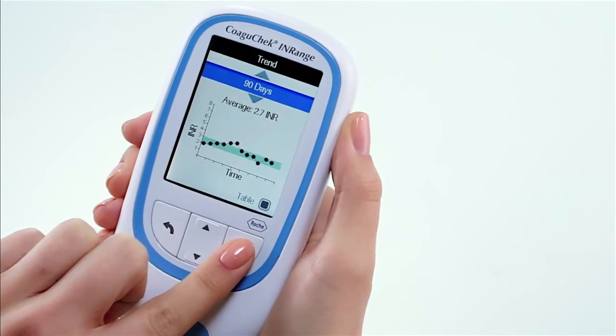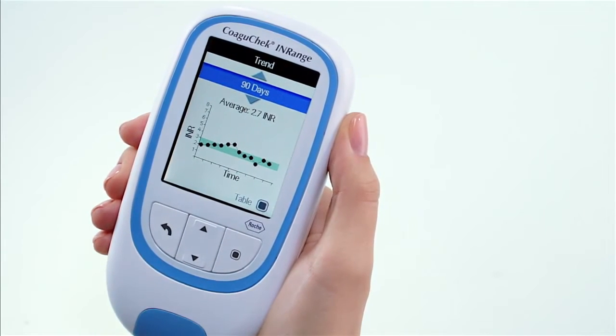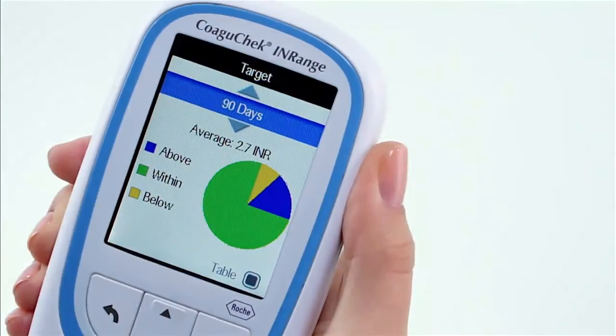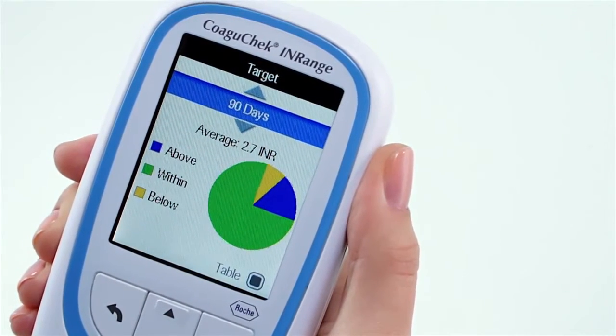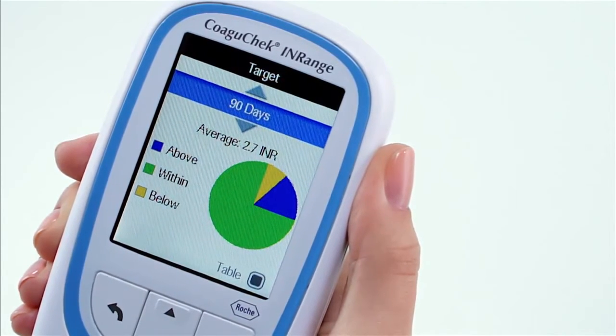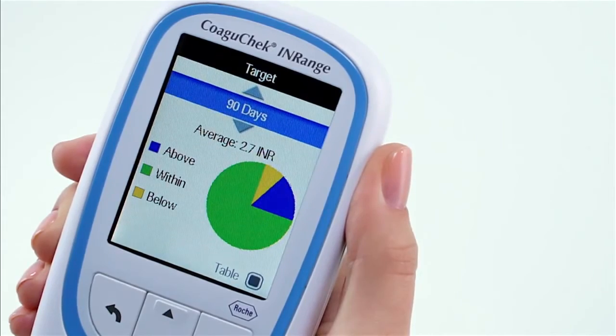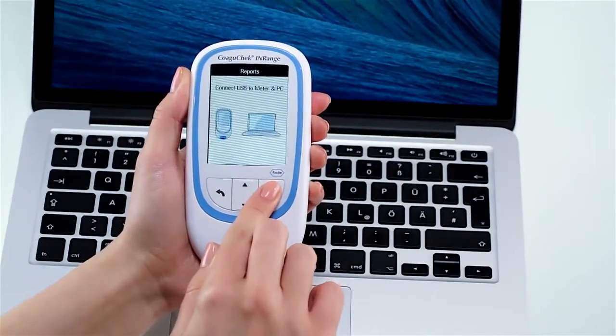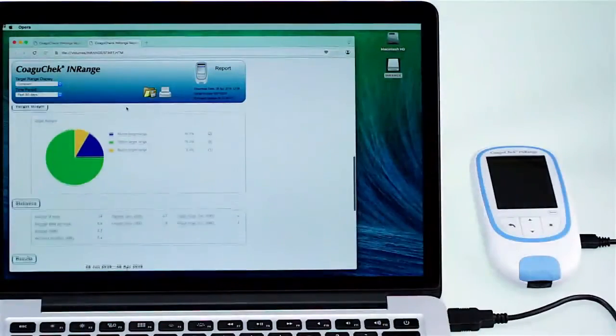Let's review the COAGUCHECK INRANGE and what it can do for you. The COAGUCHECK INRANGE enables you to track your time in range by graphically displaying how many times you have been within, above, or below your target therapeutic range. You can also view your results on a PC by connecting your device via USB cable.